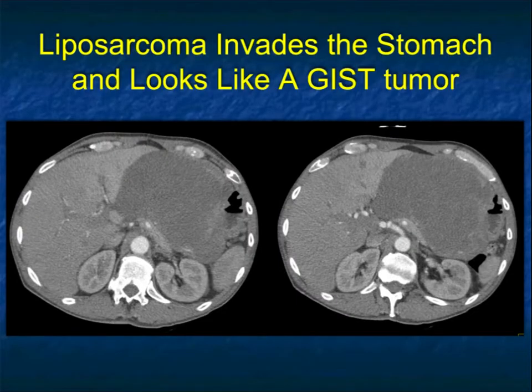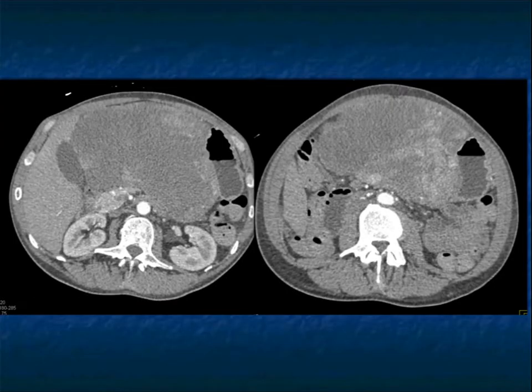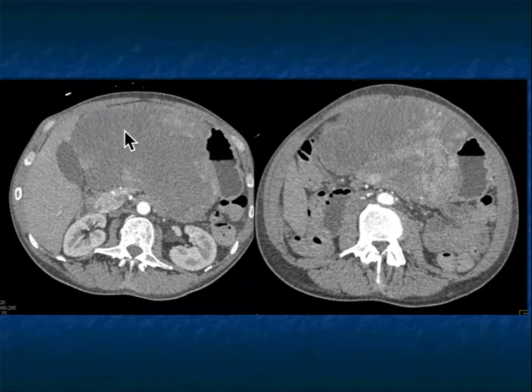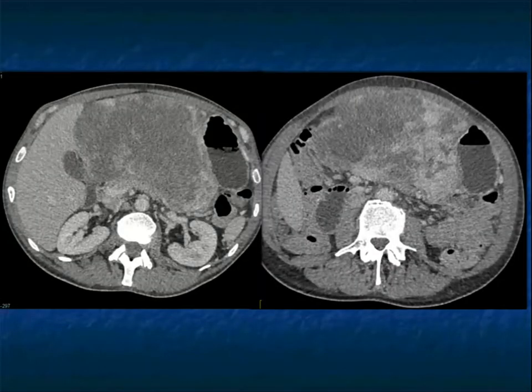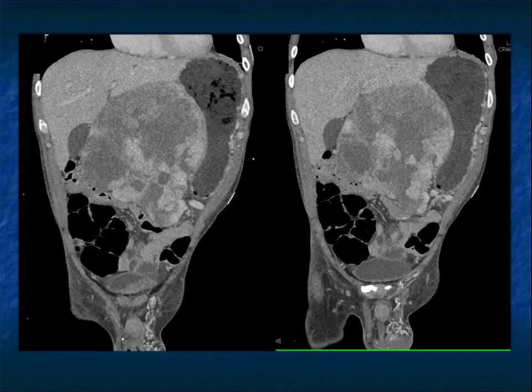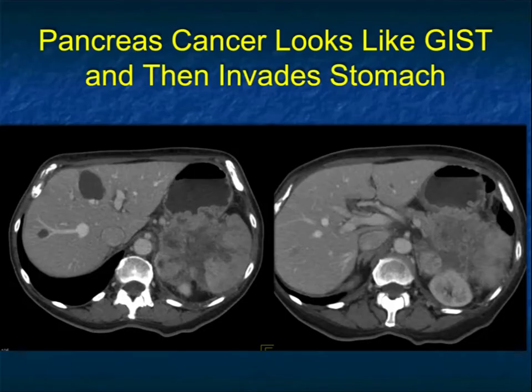Now this case — I read this as a really necrotic GIST tumor. It's a large mass, looks like the rest of the ones I showed you. This ended up being biopsied. This was a retroperitoneal liposarcoma. Liposarcomas don't necessarily have fat — this didn't. This looks all the world like a gastric GIST tumor. There's some enhancement within the lesion, some ulceration — looks like a classic large GIST tumor. Looking at the coronal views, pushing on the lesser curvature of the stomach, it really looks like a GIST tumor. So there's some overlap.